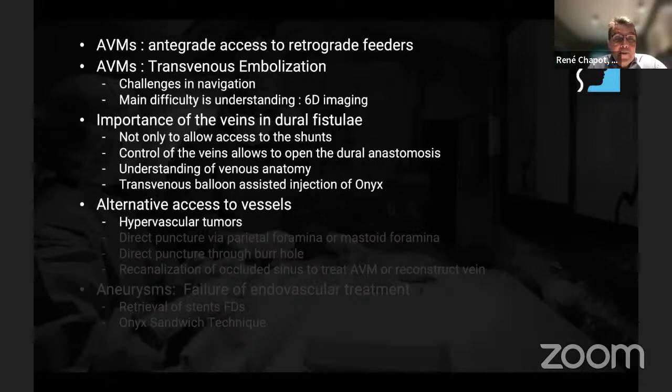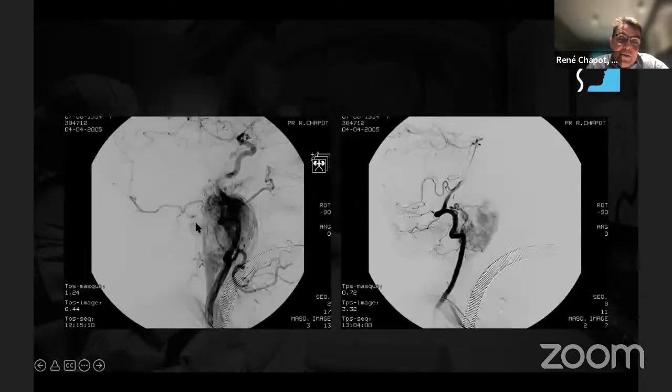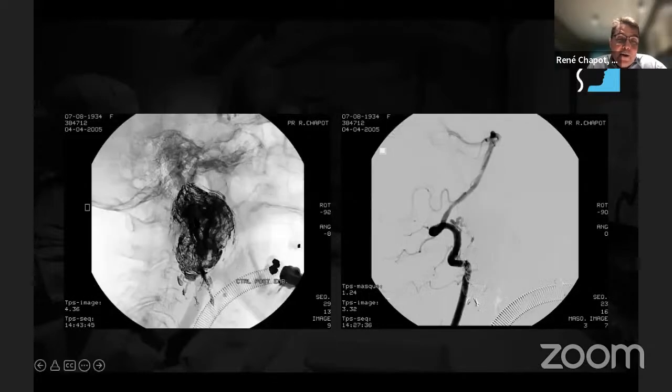Very shortly, a couple of other things. Accessing the vessels is, of course, quite often best by arteries or vein, but we have other ways to do when those kinds of tumors here don't embolize by getting through the arteries. It's too much time consuming, it's too less effective. Just take a needle, puncture it, and Onyx diffuses in a very nice way.